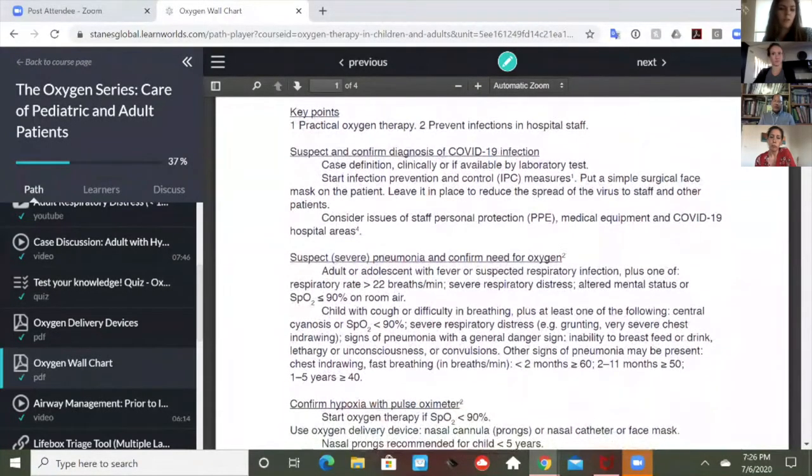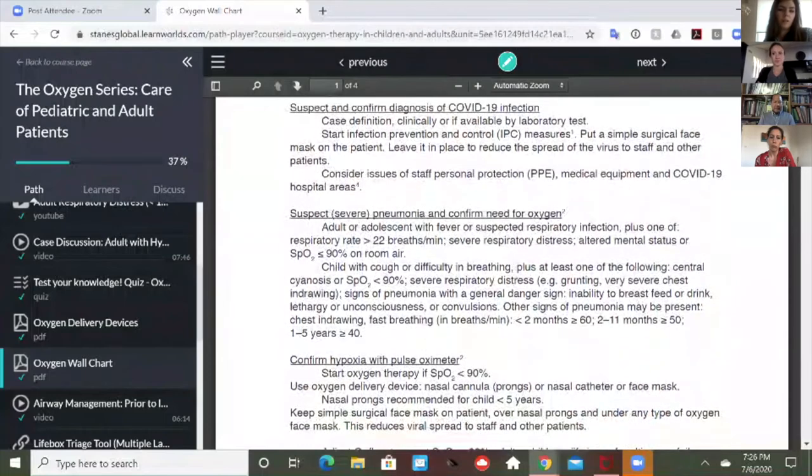To walk us through this, you would see if the patient looks like they have COVID. Does it look like they have a pneumonia? Do you have a test that's available? And then you should immediately start isolation and using PPE, which is personal protection equipment, if available. One of the questions was, should you use high-flow nasal cannula in a COVID patient? Does anyone want to answer that?